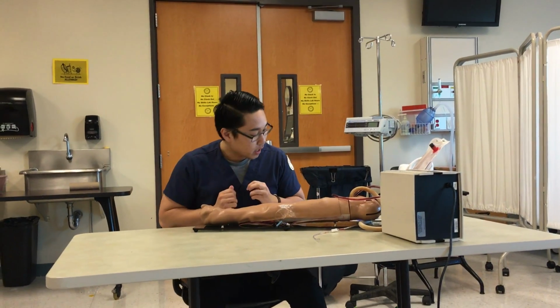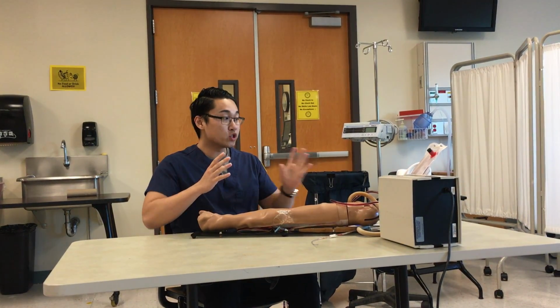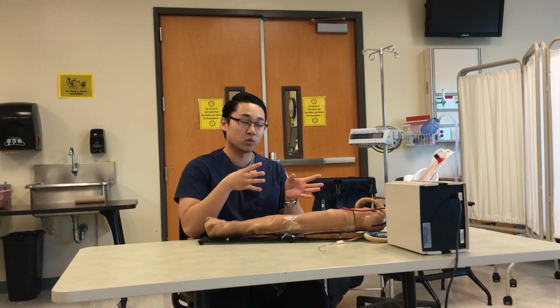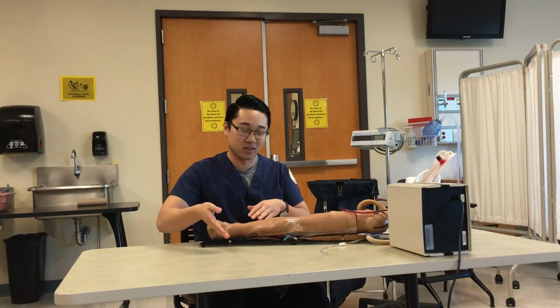So first, I'm gonna wash my hands. I'm going to determine which arm I want to do it on. Like I said before, I'm going to look at any contraindications to see if they have a shunt or a graft. A good way to tell if they can't do it on a specific arm is if you can't do a blood pressure on the arm. That's already a big giveaway to not doing it on the arm. You should move on to another arm.